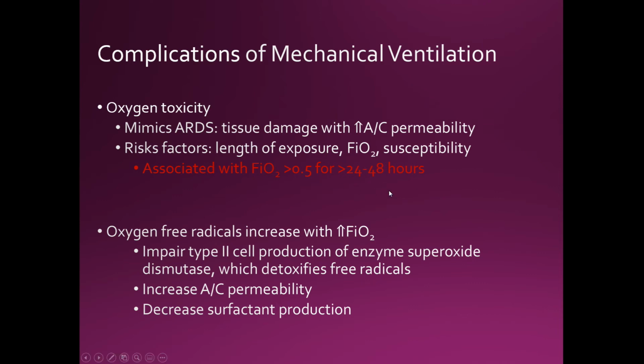And I'm doing it every night. And so, yes, I'm drying them out, but I can slowly but surely start introducing oxygen toxicity into the patient's lungs. Right? So therefore, it might have some type of difficulty in gas exchange. So if I took a blood gas on them, I may have some abnormalities, and that might not just be due to the disease process, but it might just be due to night shift people leaving the SVNs on almost all night.